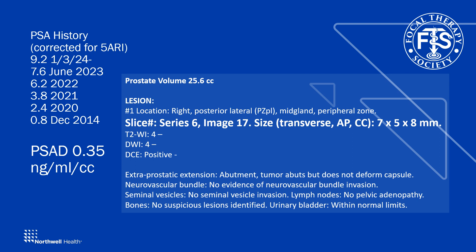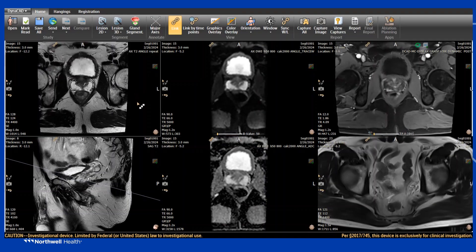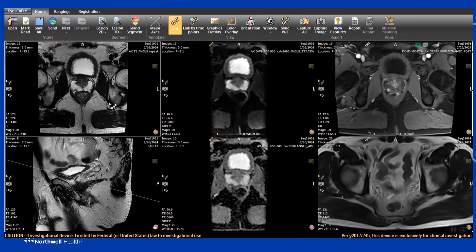The lesion is 7 by 5 by 8 millimeters, but you'll also see how we contour the entire lesion, which may be larger than what's been reported. Hello, good morning. Today we'll be going over how to segment using Dynacad for your upcoming fusion biopsy.